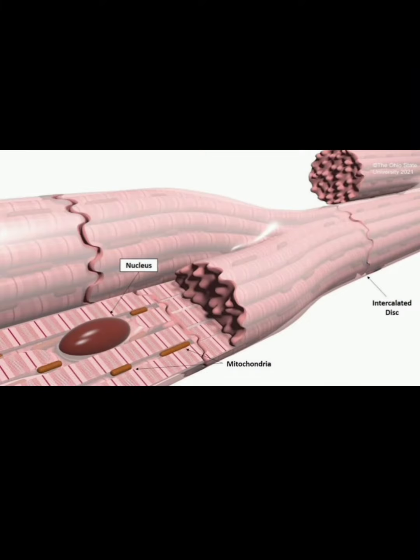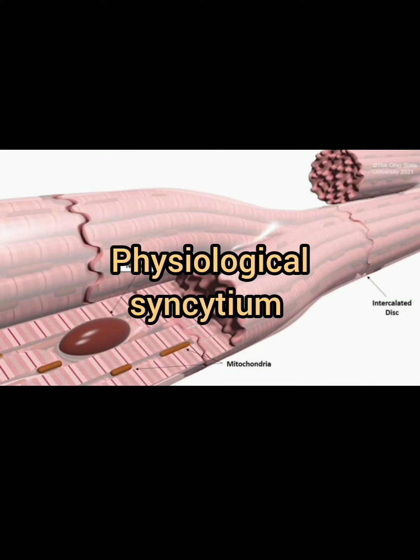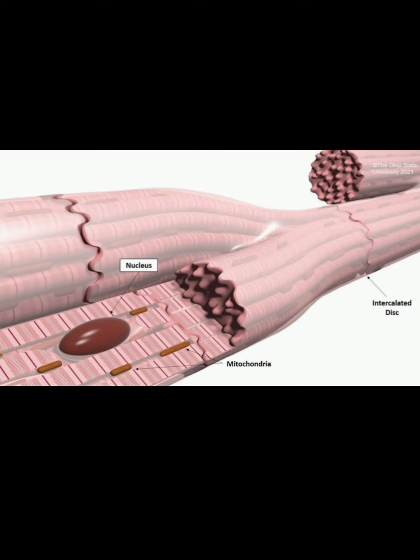These are cardiac muscle fibers which are short and branching. Here it is branching. These are the cell junctions. Due to infolding of the cell membrane, cell junctions appear as intercalated discs. Here it has tight junctions and gap junctions. Gap junctions make whole cardiac muscle a physiological syncytium. Because of less myofibrils, nucleus is occupied centrally and striations are weakly seen.